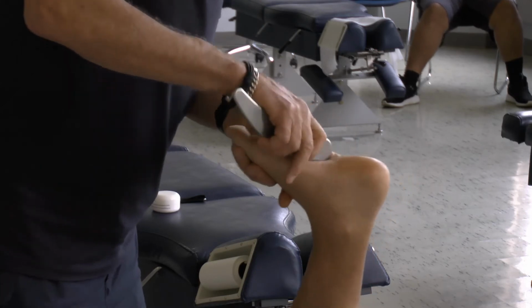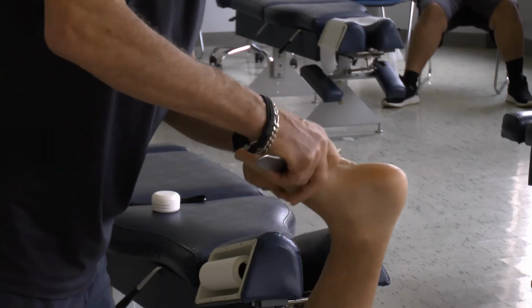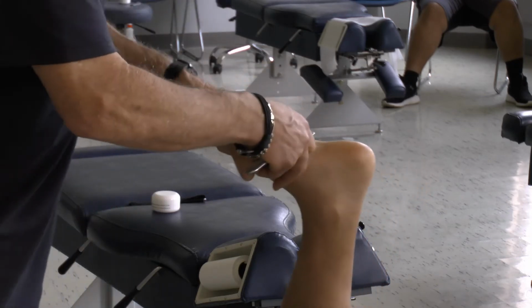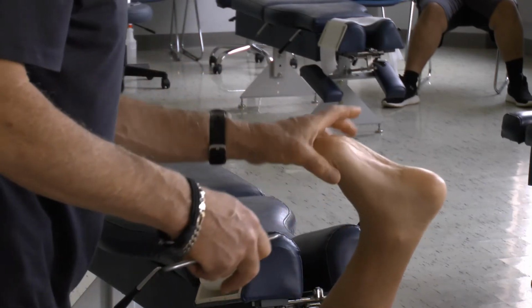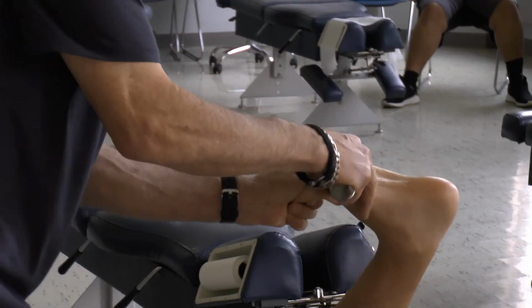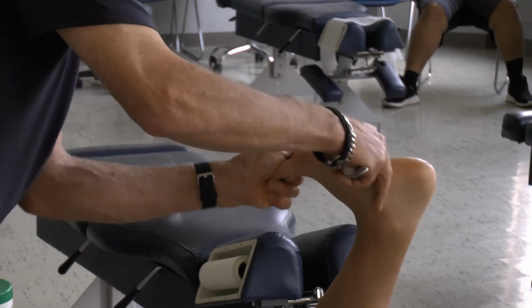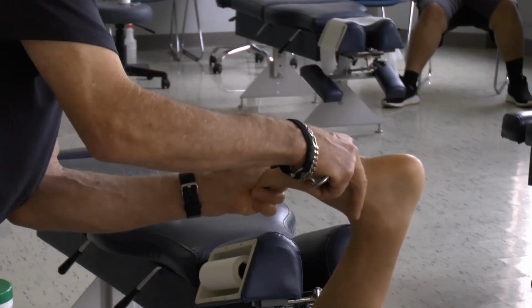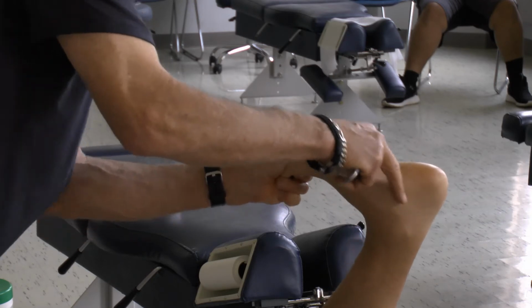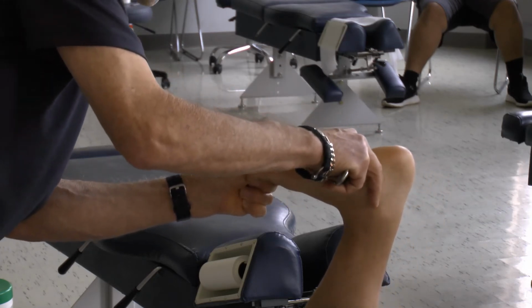So I generally don't go directly to the spot, right? I just work the entire plantar fascia. When the toes are dorsiflexed, that's when the fascia tautens, right? So it allows me to get a good stretch, and you can feel some of that crunchiness in there as you come across. I'm just working my way from the toes back towards the heel.